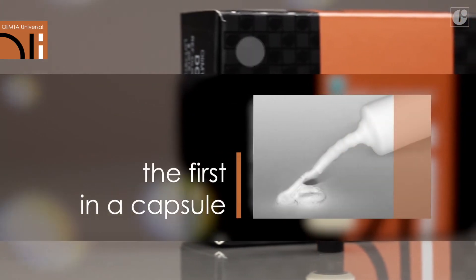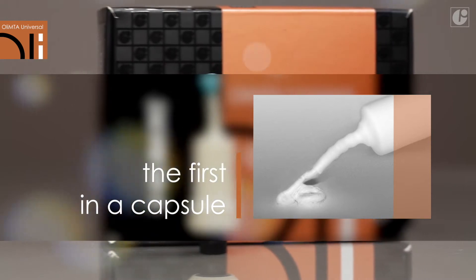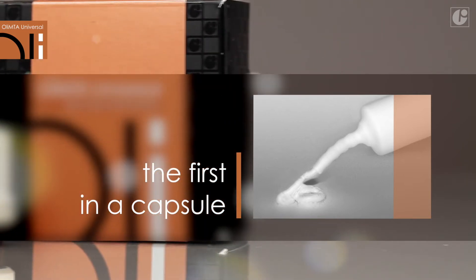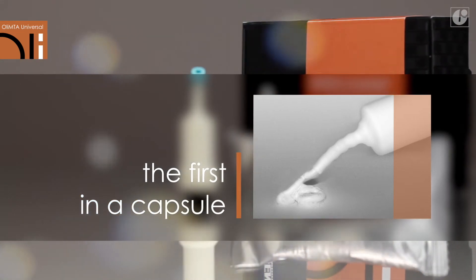The capsule form of OliMTA Universal is unique and provides exceptional comfort during application. After automatic mixing, the material is ready to be placed directly in the treatment area. This is the first solution of its kind to be used in MTA cement.